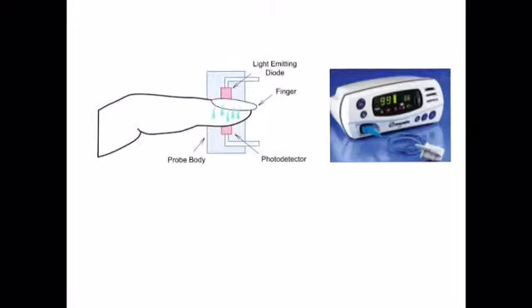blue purple color. The oximeter first measures the sum of the intensity of both shades of red. This is representing the fractions of the blood with and without oxygen. This device detects the pulse and then subtracts the intensity of the color detected when the pulse is absent. The remaining intensity of the color represents the oxygenated red blood. This is displayed on the electronic screen, which is on average 95 to 100%, as I already told you.